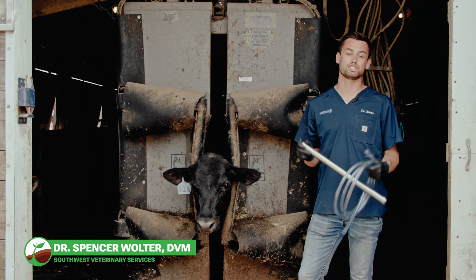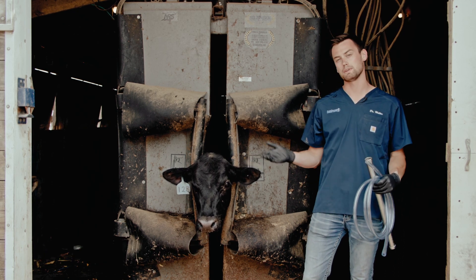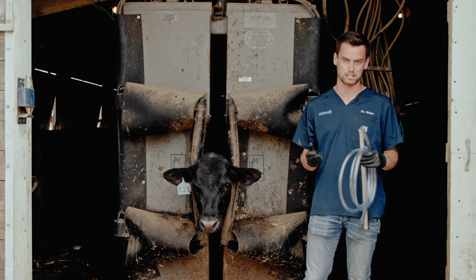Today we're going to talk about how to tube or let down a calf that is bloated. Bloat is a very common problem found on feed yards, so being able to do it in a timely fashion is important.